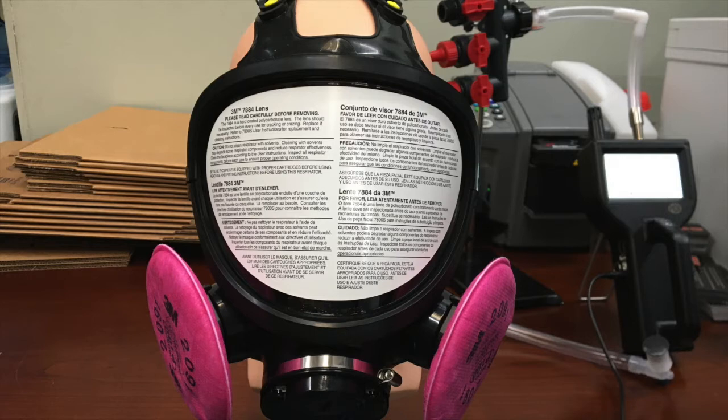You can definitely see the increase in quality in this mask and the reason for the price point being two to three times higher than the 6800 mask, for example.